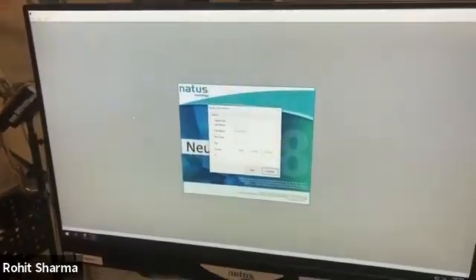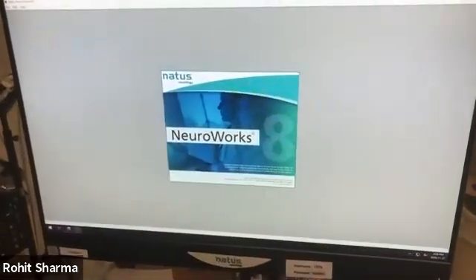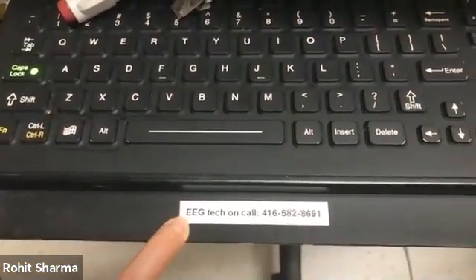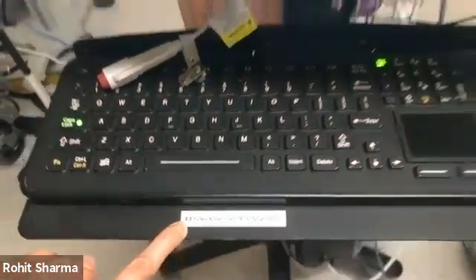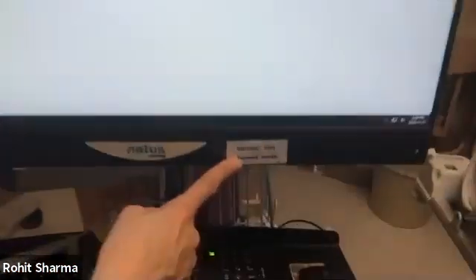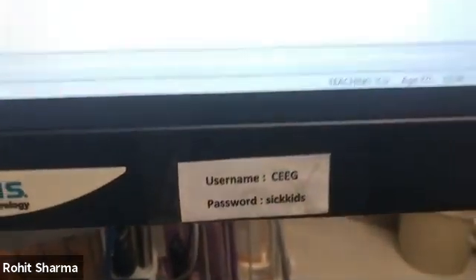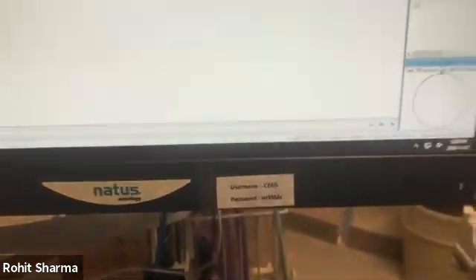If it's too much, there is a technologist on call. You can always call us. The technologist page and number is also glued onto the EEG machine board, and the username and the password is also on the machine in case you need to do something to the machine.